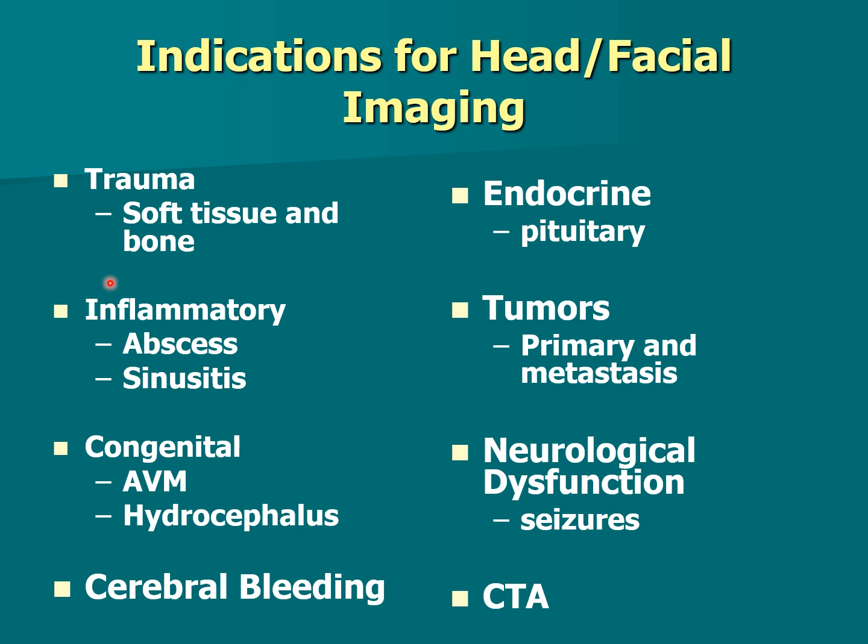There's a lot more prep to do an MRI scan. I have to get a lot more patient information about what kind of implants they might have, or if they're coming in from trauma, they might have pieces of metal or gravel or other things on them that we couldn't scan. Whereas in a CT patient, all of that may make a little artifact, but it is not going to damage them. So CT is great for trauma to show everything.